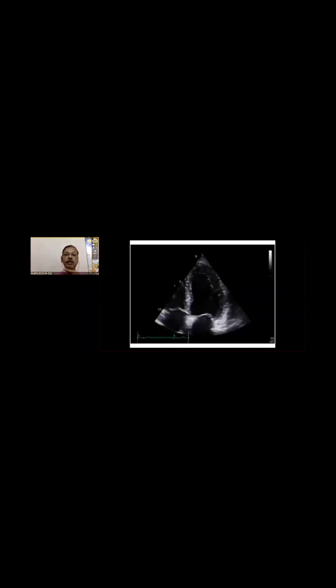I'll give an example of two patients. See, this is a 42-year-old lady. She was discharged in a stable condition after a stormy course in the ICU, and we have done the echocardiography. It is absolutely normal, but she is complaining of dyspnea on exertion. But if you do the GLS in this patient, it is 22.8%. So we can tell there is no subclinical myocarditis or subclinical myocardial dysfunction present in this case.